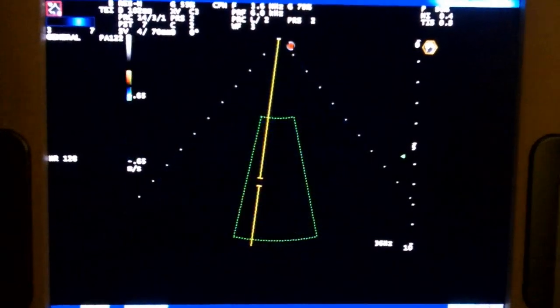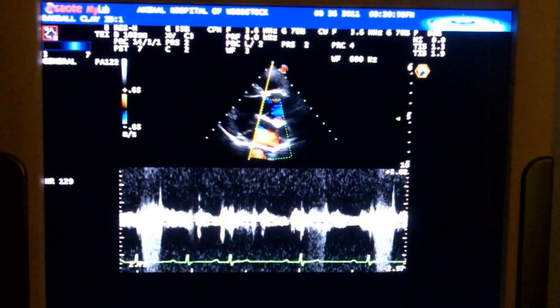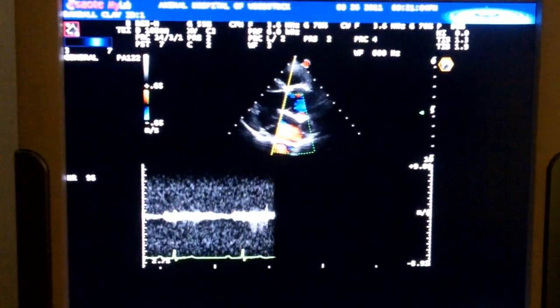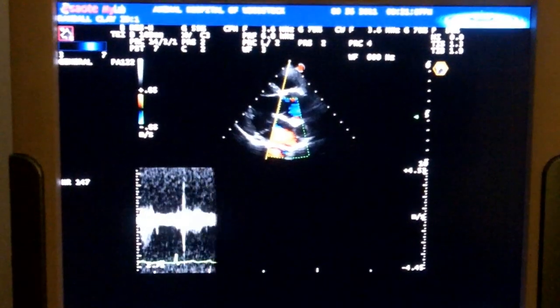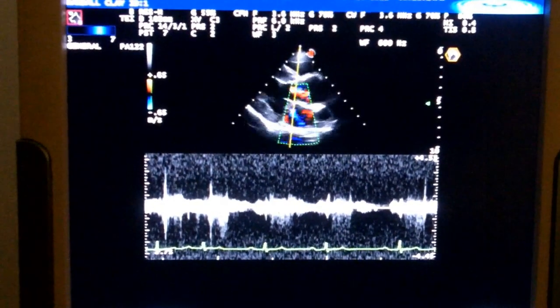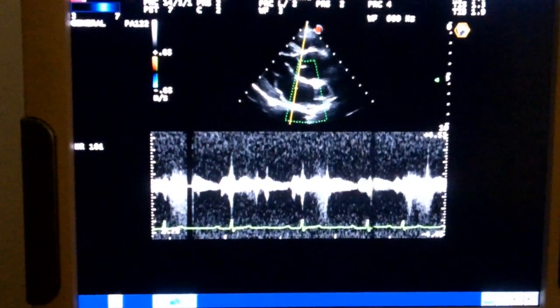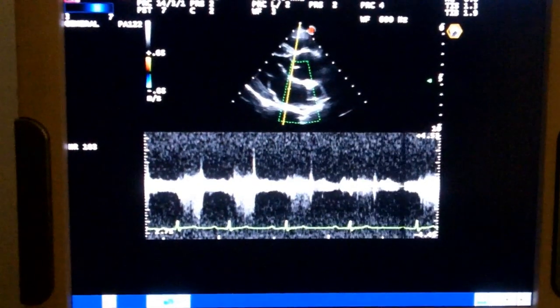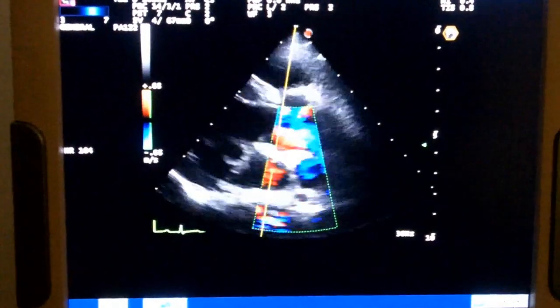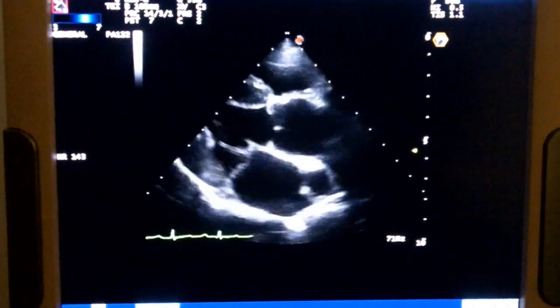Let's take that off. If we take the PRF up — that might be too much. We'll come back at that from another direction. But we can see that we've got a velocity that's approaching around 5 meters per second or so.